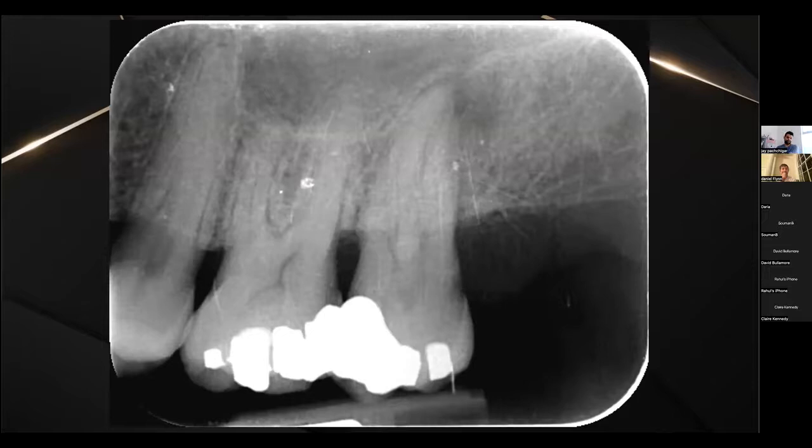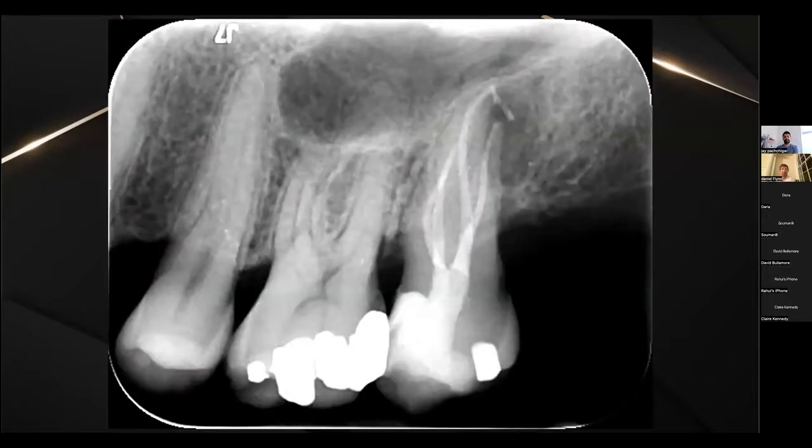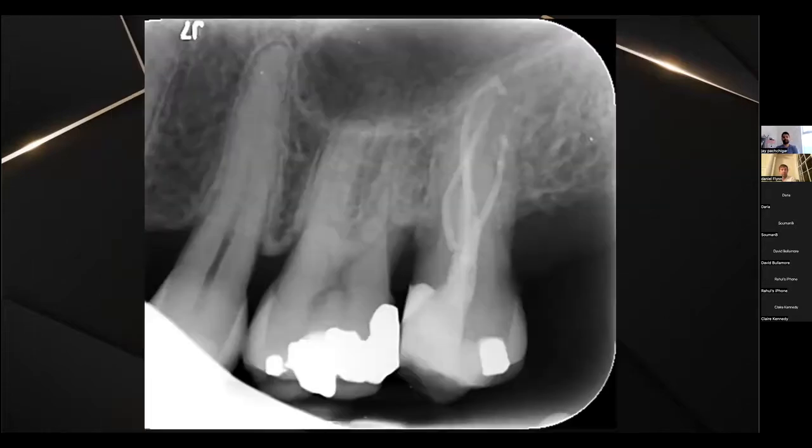So this was the pre-op. I just skipped past the end of that video by accident there. This was the post-op. Again, I'd locked that tip into the palatal canal, so you do have a bit of extrusion, but again, I'm not overly concerned. These sealers are very, very biocompatible. And again, at the follow-up, very nice healing of this tooth.